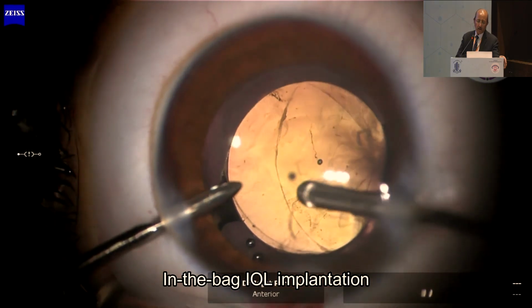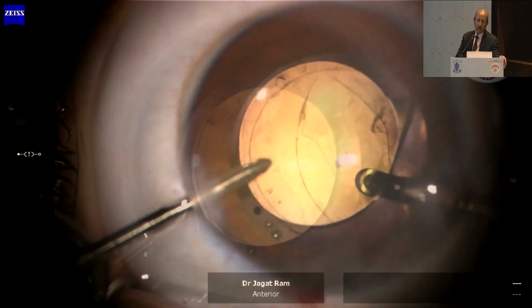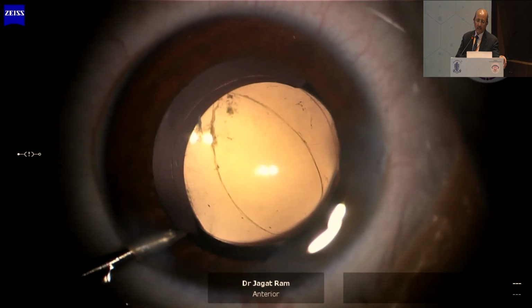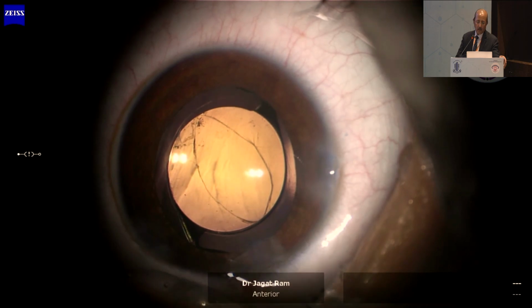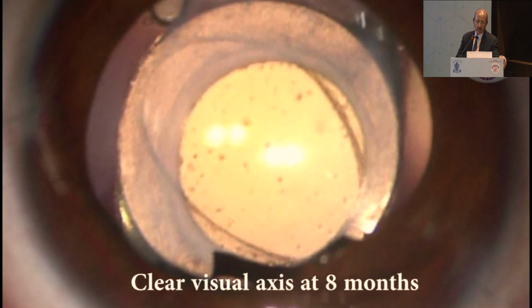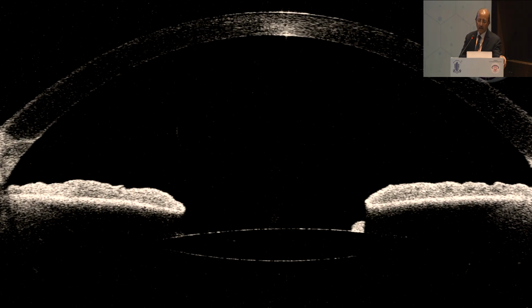And whatever vitreous is there at the site of the pre-existing rupture is cleaned, and surgery ended. And this is 8 months after, with a clear visual axis. This is the anterior segment OCT.